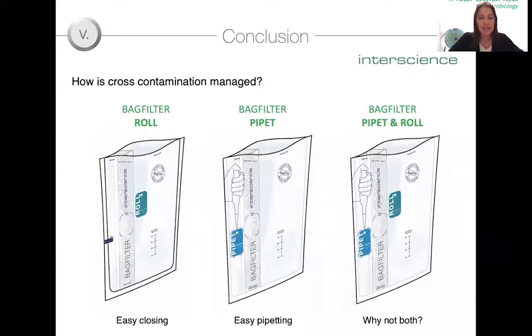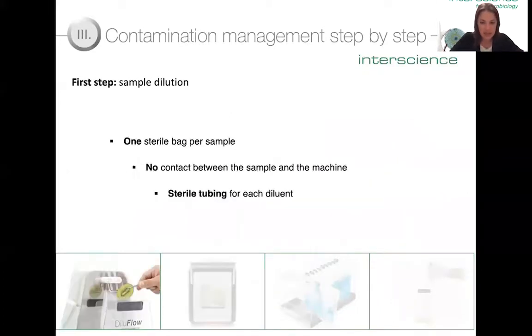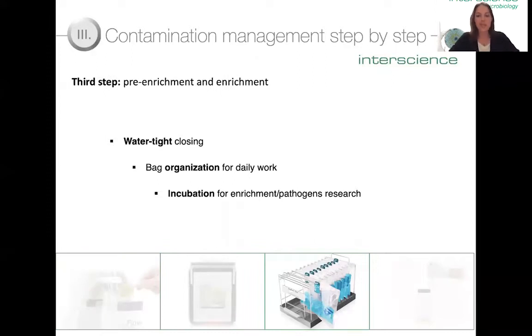And then a question about the ergonomics of the bags. Let me get back to the slide where I show how it slides on the rack. At the bottom here, you see we've designed a rack. When you incubate the bags, you are supposed to leave a certain amount of space so that air can circulate between the bags and maintain a homogeneous temperature. So we've designed this bag rack slide, I believe is what we call it.